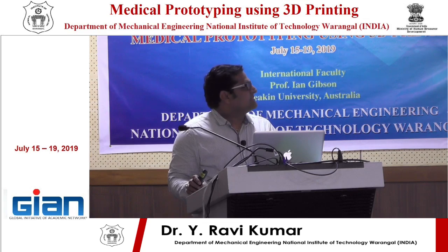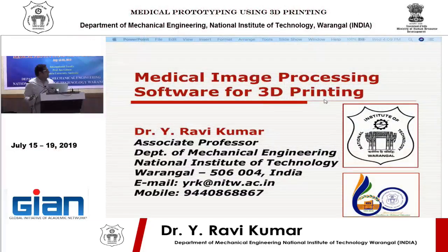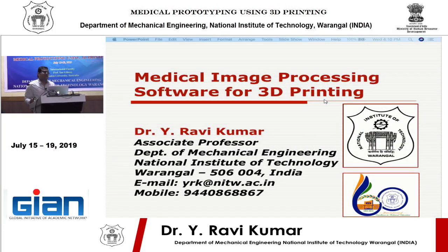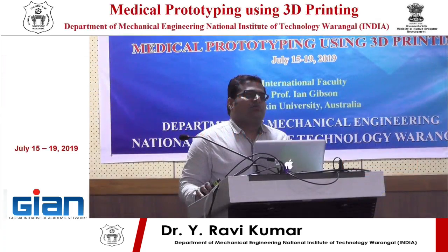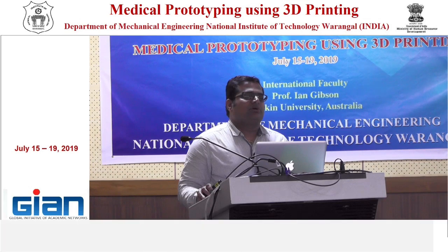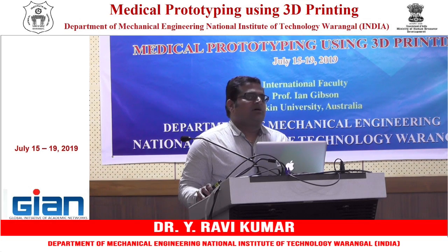In this lecture, this is basically medical image processing software for 3D printing. So, as we know, one route is you can do a modeling, convert it as an STL file and print it, or in medical applications you start with CT or MRI or ultrasound or PET, any medical data acquisition system. So that is the start point.